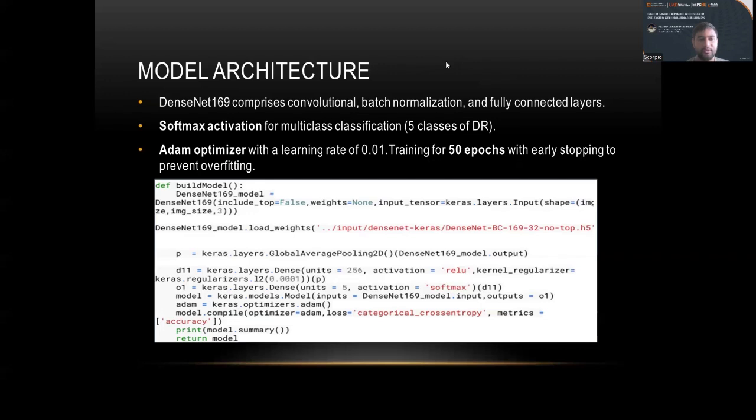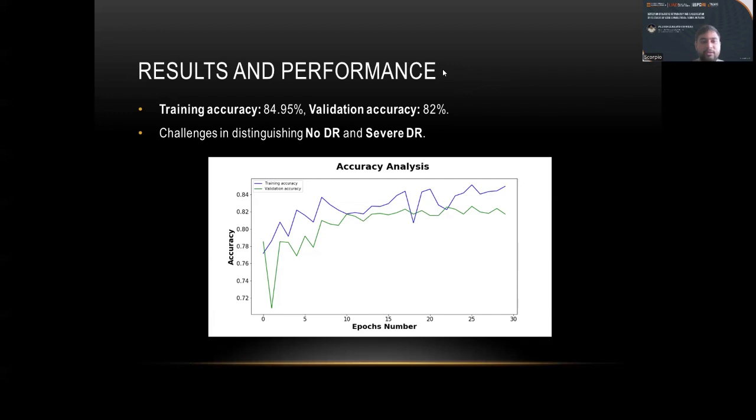This helps to prevent overfitting, where the model becomes too specialized to the training data and performs poorly on new data or unseen data. Key takeaway here is that the model strikes a solid balance between fitting the training data and performing well on the validation set.